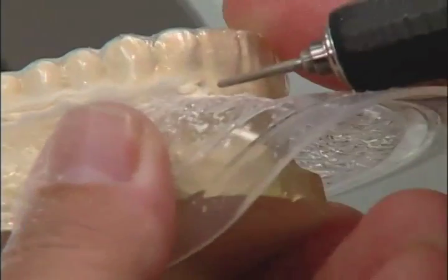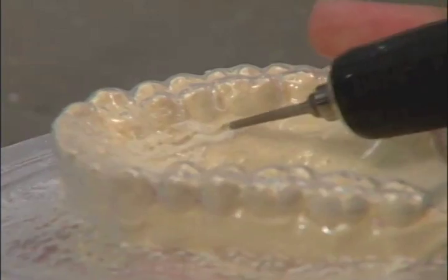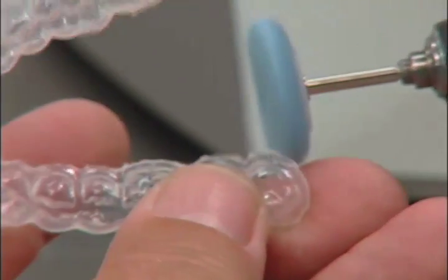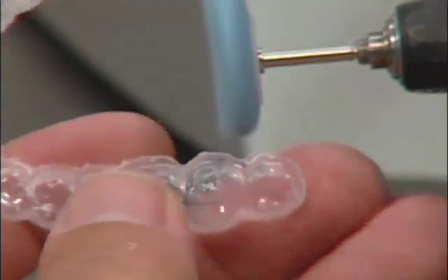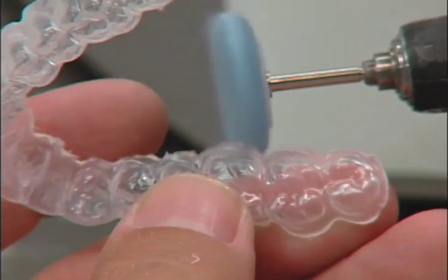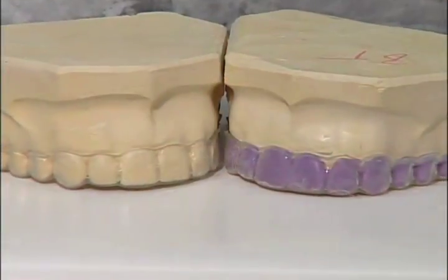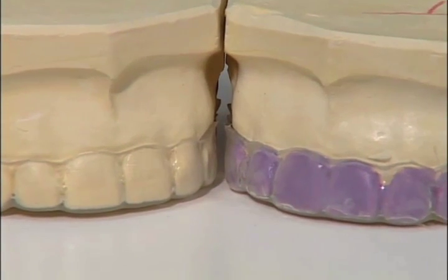If you wish to carefully trim around the gingival areas, the twist drill should be used. Note how easy it is to trim around the gingival areas. After the twist drill, use the Lisko S burr to smooth and polish the edges. The ErcoFlex 1 mm material can be used with reservoirs or without.